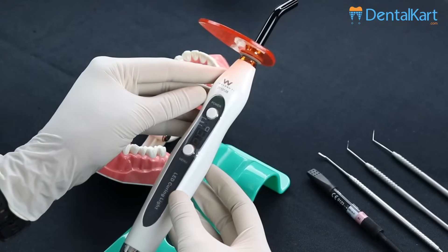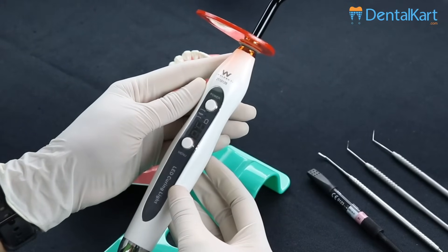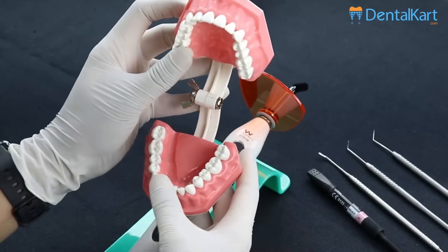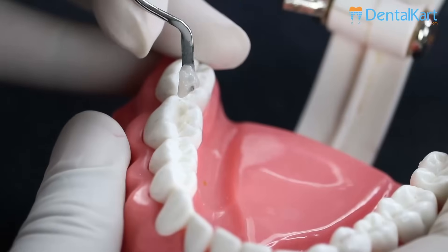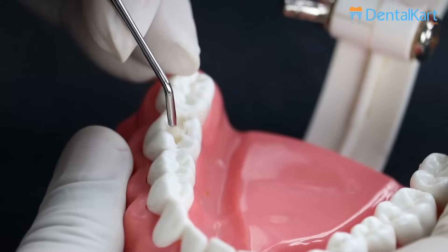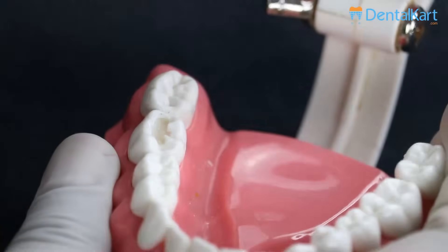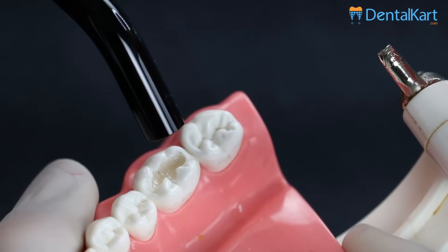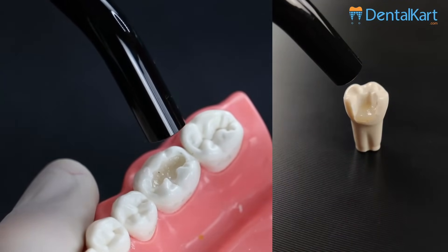Now I will be showing how this Valdent Eco Plus light curing unit works. For that, I have already prepared a cavity on this typhodont. Now I am putting the composite material in the already prepared cavity. Let's cure this composite material with the Valdent Eco Plus light curing unit for 20 seconds.